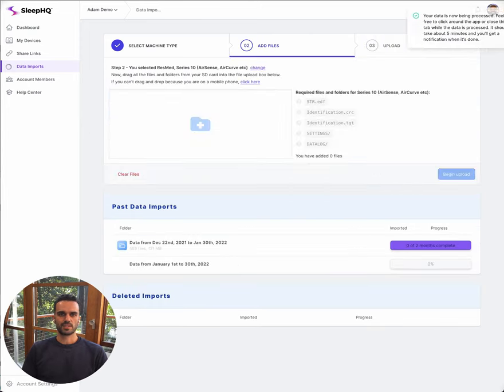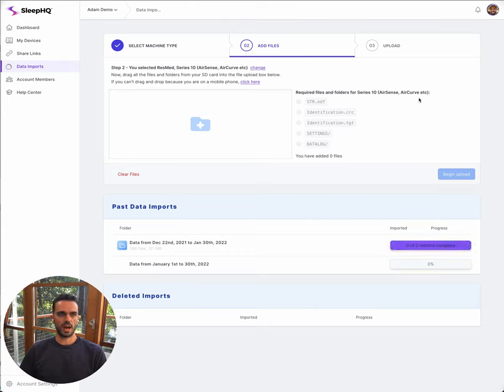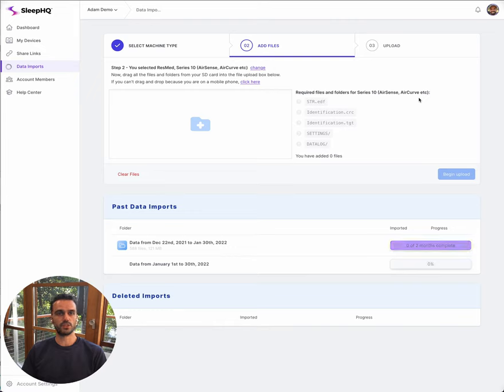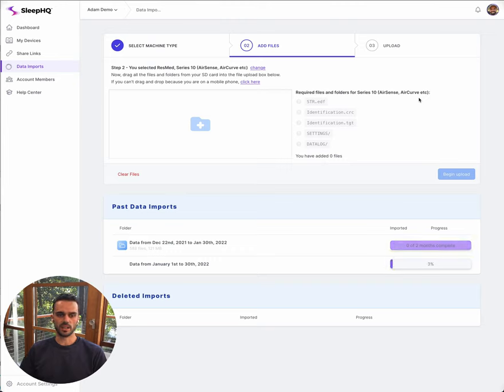My data has just finished importing and now the next step in the process is the server needs to process all of my files. At this point you can now click away from the web page, you can close your browser if you want and come back to it later on. Depending on how much data you've added, it might take five, maybe ten minutes.